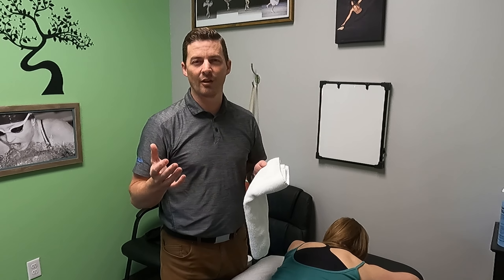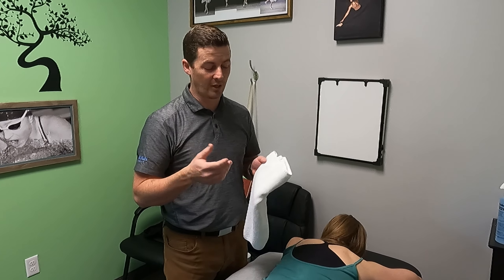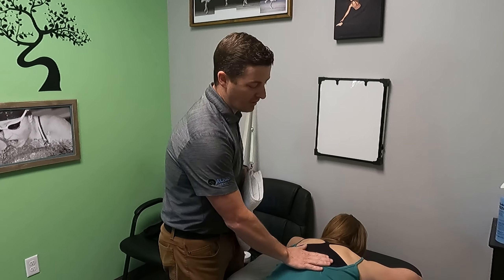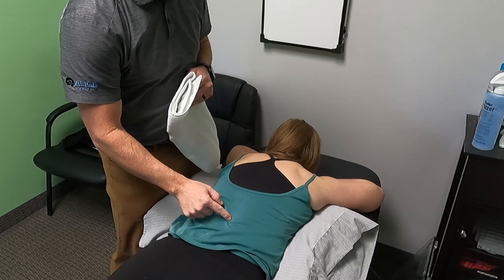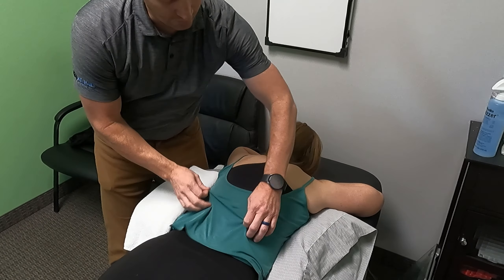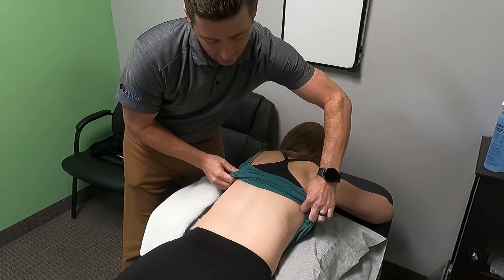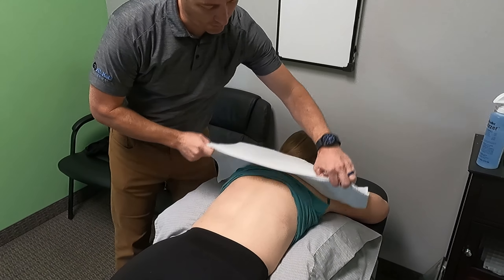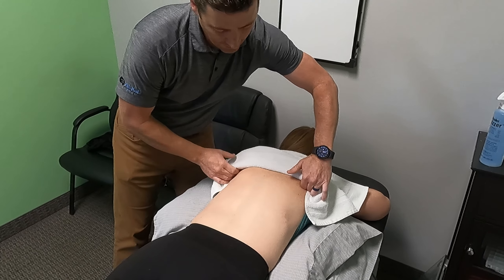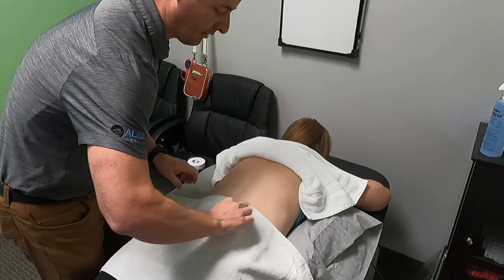I'm going to show you the ASTYM technique and how it's helpful and what you need to look for with scoliosis. If you're someone who has scoliosis and you're being treated by a physical therapist who does manual therapy — scraping, IASTM, ASTYM, Graston — hopefully this helps. So with Dionne we have a right thoracic curve. We're going to get to that area here. I'm going to use some cocoa butter on her skin and tuck a couple of towels in so we don't get it on her clothes.